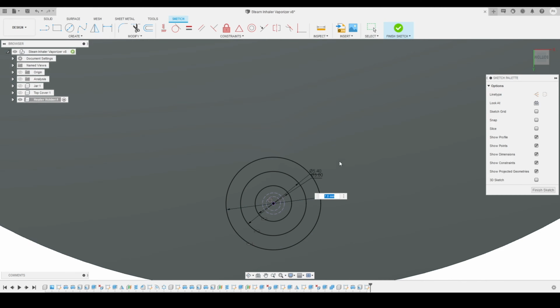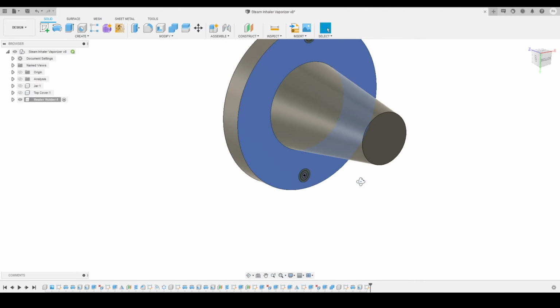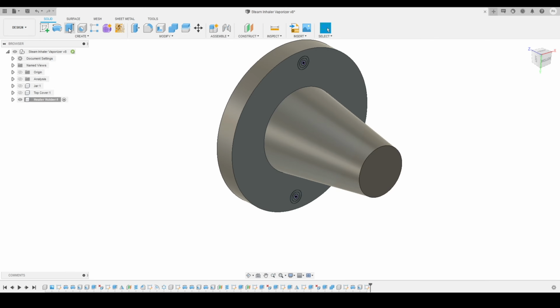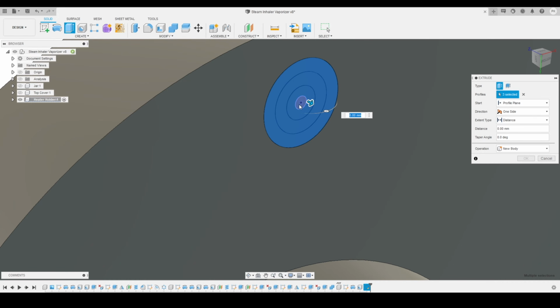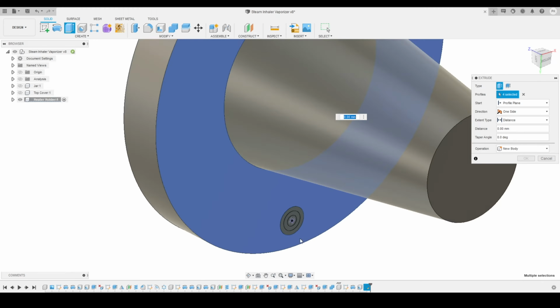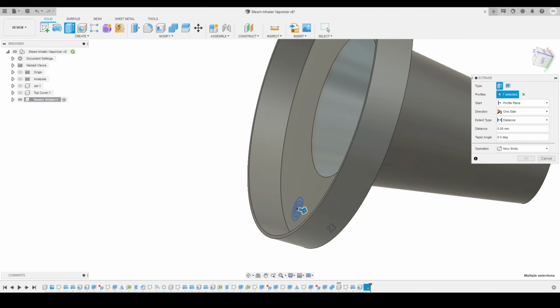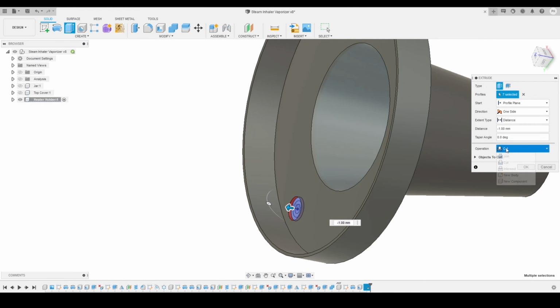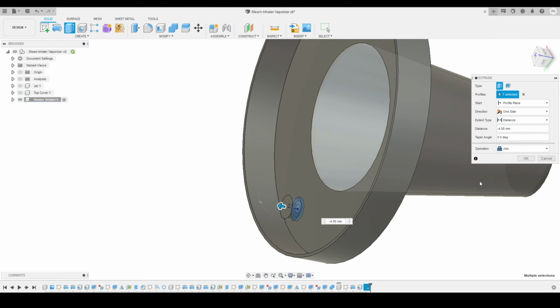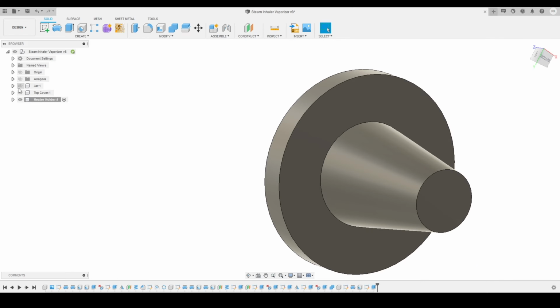So I will just click on finish sketch, and here you can see we had created our sketch. Now we'll activate my extrude tool. We'll select this profile, and this profile. I will select all the profiles and we'll do the same on the other side as well. And now I'm going to extrude it towards the opposite direction. So for that I will just provide the dimension here. So instead of cut, I will make sure that the operation is join and minus 4 mm, and will press OK. So you can see the shape has been joined with the current body.